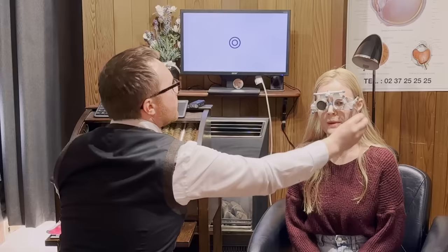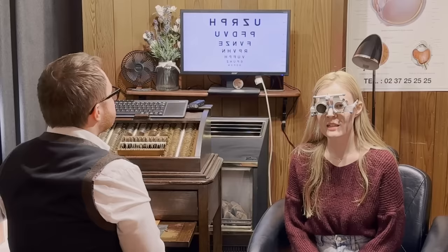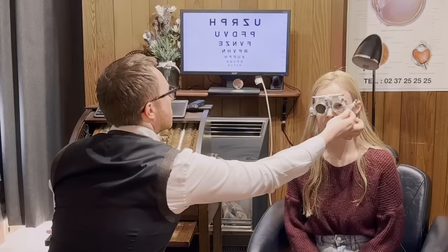So let's go back to looking at the letters. And what's the smallest line that you can get at the moment for me? I think second from the bottom. Okay, yeah, do you want to read that one? E, P, U, H, Z. Very good. Now, as you're looking at that line of letters, would you say it's better or worse if I put that in front? Better.